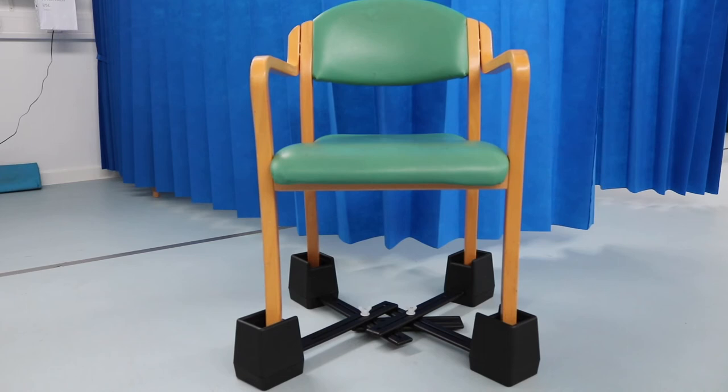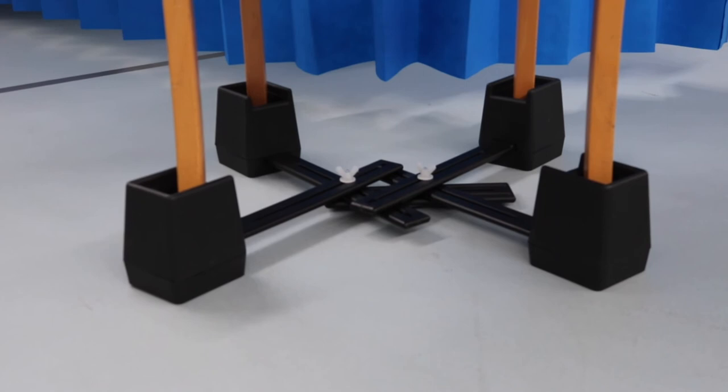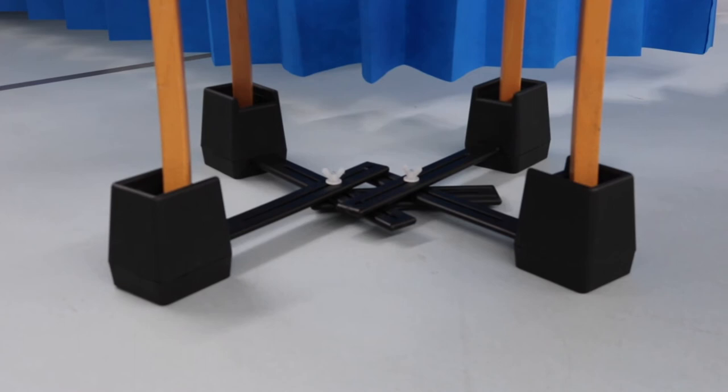On the bottom of this chair here you can see some chair raisers. These allow us to raise the height of your chair at home so that it's the right height for you, so you're not bending your hip too much, or to make it easier for you to stand from the chair.